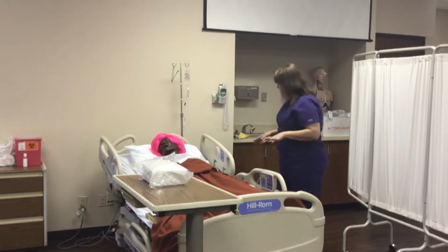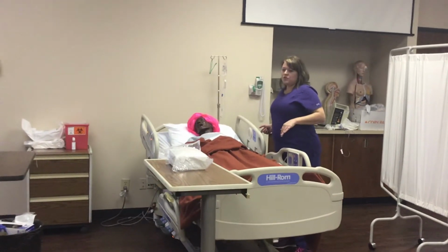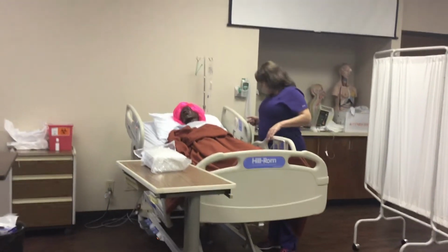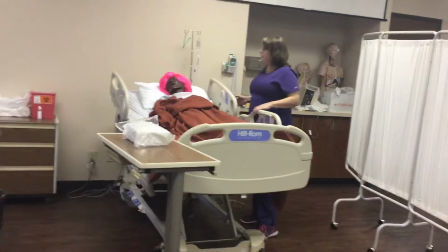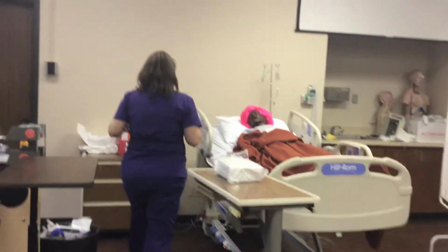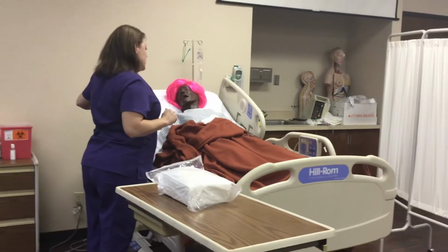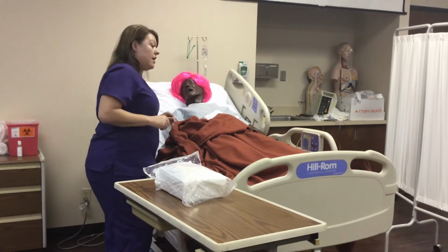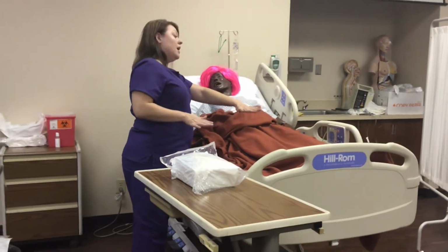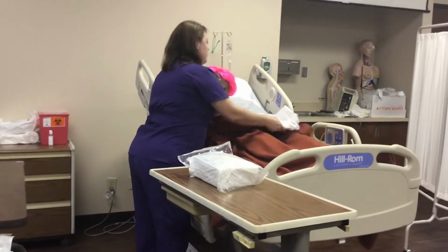So I'm going to go ahead and raise your head up to waist height for me, just so it's easier for me to work. I want to make sure that you're comfortable as well, though. Okay. I'm also going to come around this side before I lift you up. I'm going to let you up into a semi-sitting position. Now, for this catheter, I'm going to need you to bend your knees and lift your feet, facing flat on the bed for me, about 2 feet apart. Can you do that, or do you need some help? No problem. I can help you do that.